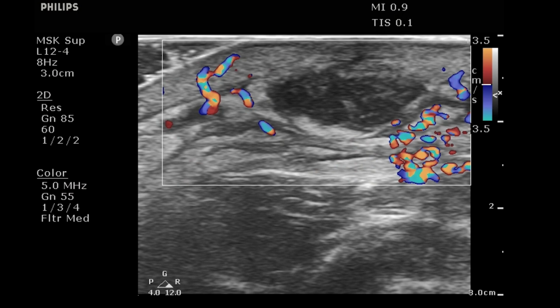The other thing that you may see is hyperemia, right? Because we have all that increased flow, increased capillary permeability, we're going to have some extra flow around that area. And so if you put color on, you may see a little bit more color there as opposed to other normal tissue. So making that live, you can see that abscess and that hyperemia.